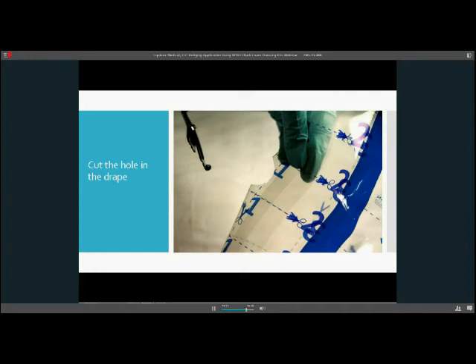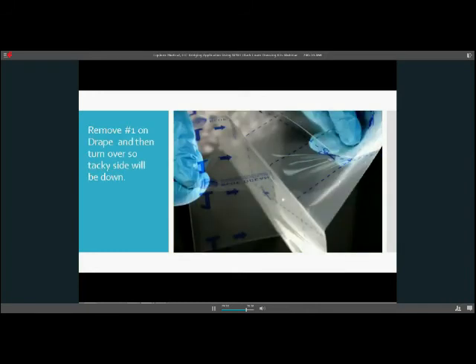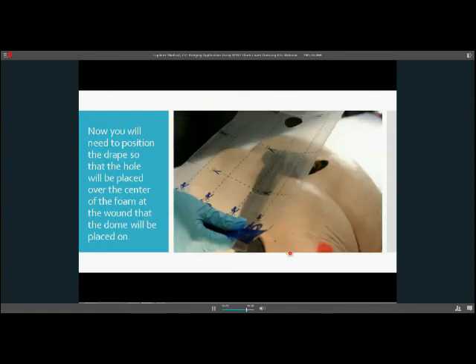And as you can tell, these lines are where you would cut. That makes it easiest for you to still have all number 1, all number 2, and all number 3, so you're not going crazy with your transparent leader. I folded my drape in half, and I just cut a nice clear circle. Nickel size hole is what you're looking for. By doing it this way, I get a nice hole. It's not going to tear.